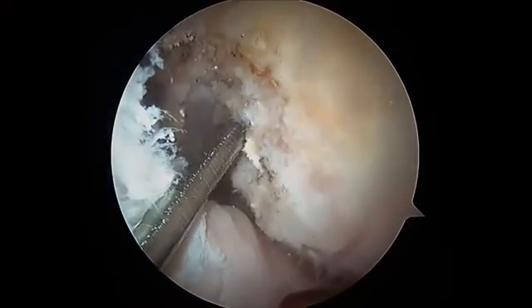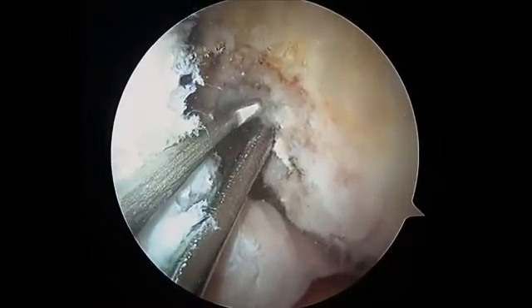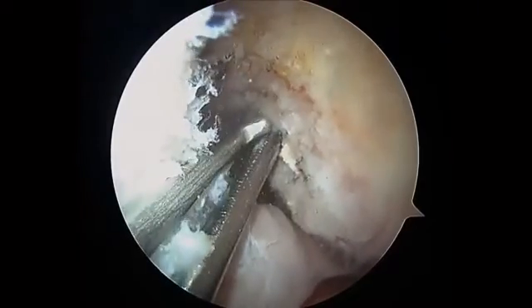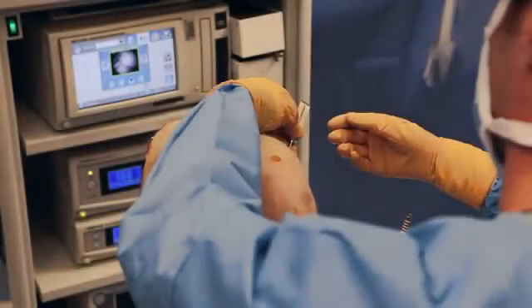So this is the highest portion of the footprint, lowest portion of the footprint. So we're still within the footprint. We're still anatomic, but we're not dead center in the central region of the footprint. We can measure our intraosseous length with the depth gauge here. This looks like this tunnel. Our intraosseous length is going to be about 35.